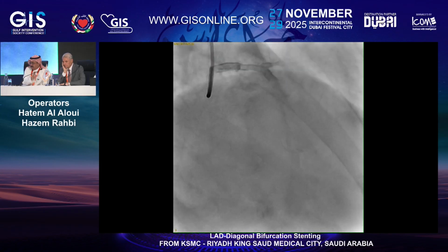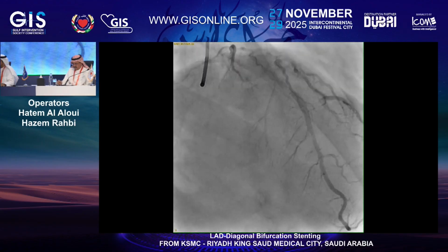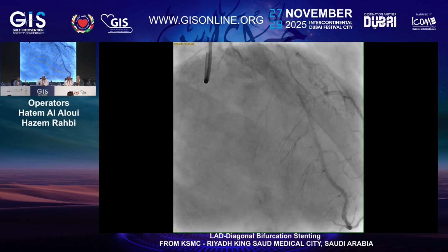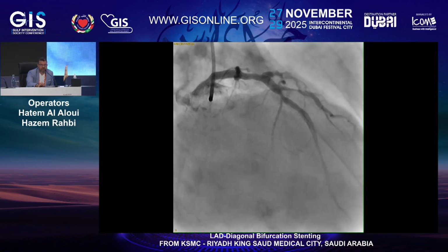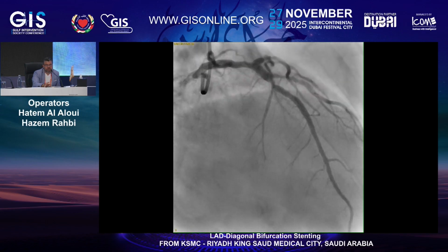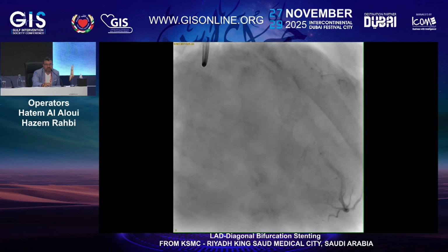Dr. Wa'il? Really an interesting case. First of all, I agree totally that 7 French, if you have a good radial, is a guiding of choice in most of the cases, especially bifurcation cases.